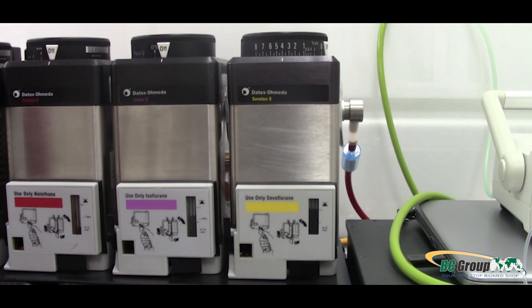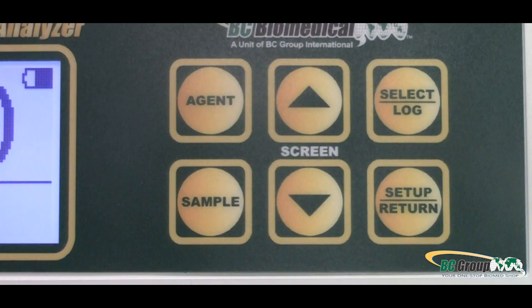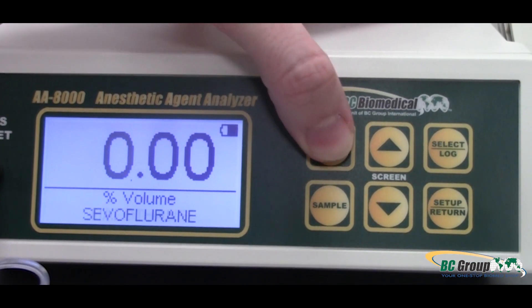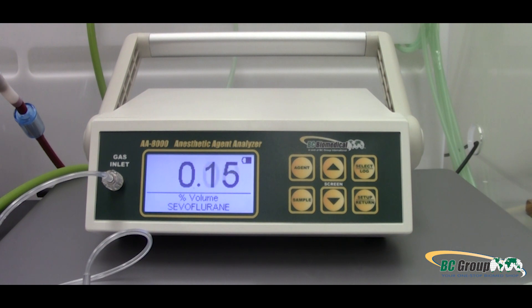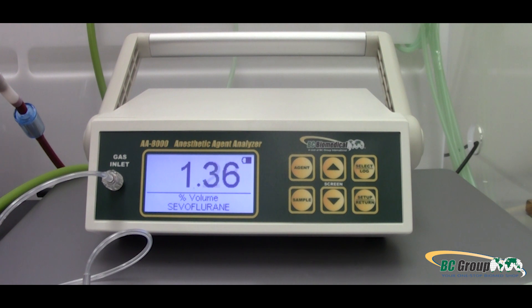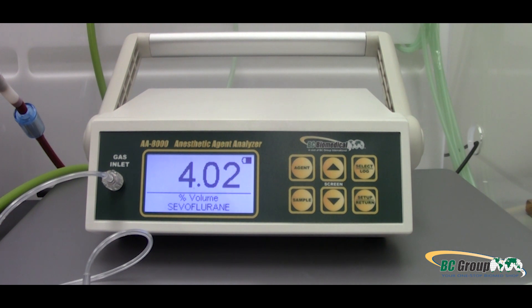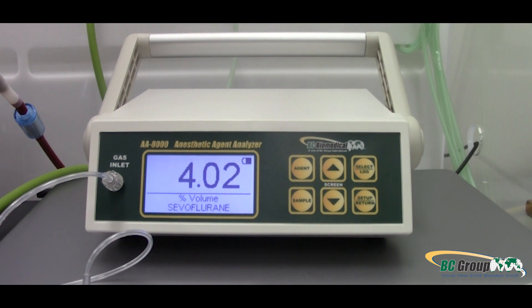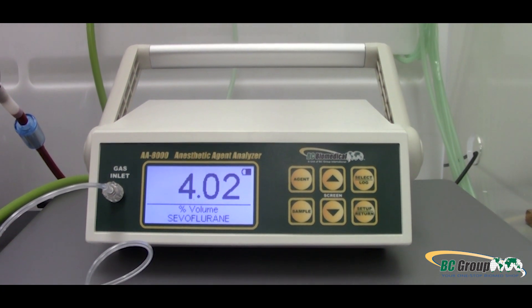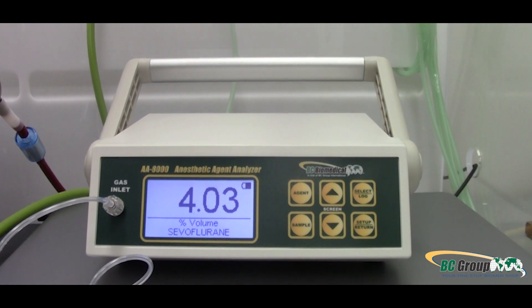We will begin by testing sevoflurane. Press the agent button on the front of the AA8000 until sevoflurane appears as the agent being measured. The AA8000 has a sample pump that draws sample gas through the unit. Your reading will be plus or minus 0.05% of volume percent plus 4% relative accuracy. The AA8000 will also be impacted by the vaporizer accuracy specifications.